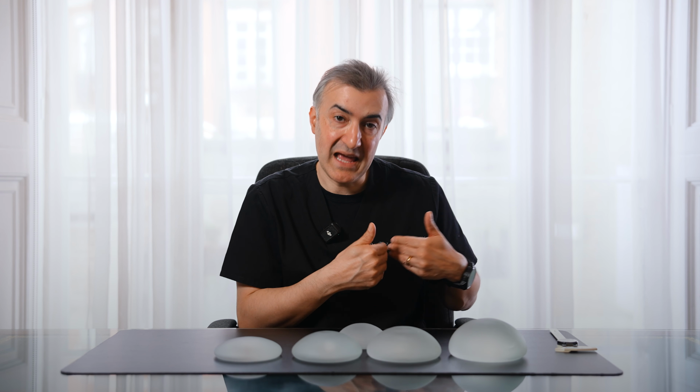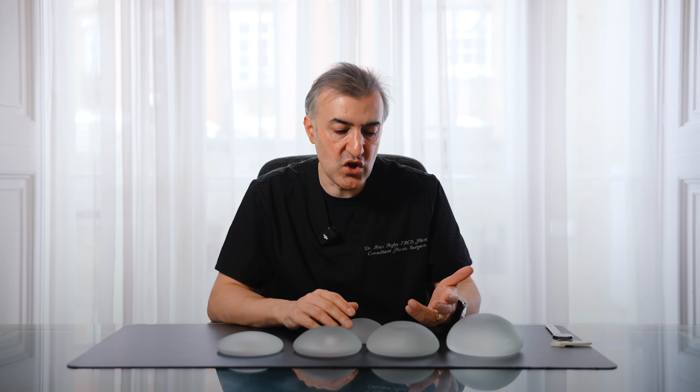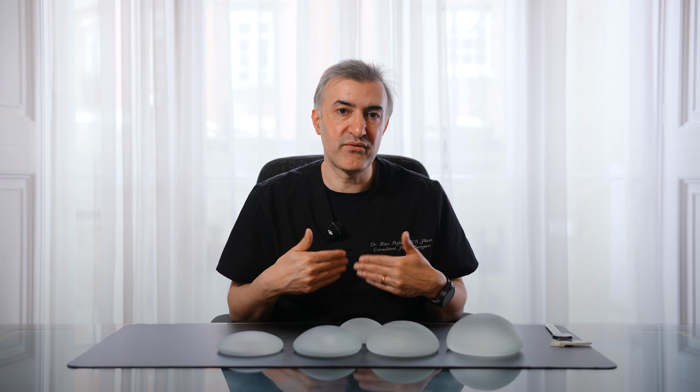Now obviously patients often come in and go, well, I like the way she looks, but they've got a different anatomy, they've got a different situation beforehand, so you often have to say that that looks good with that patient and their particular base width and their degree of soft tissue laxity, how easy it is to move their soft tissues and how much space they had. And so you can't always compare exactly with a different patient and go, okay, they look good with a 320cc, so therefore I want a 320cc. Each and every time it's a bespoke decision for that individual patient as to what will fit their frame and what would fit their goals.